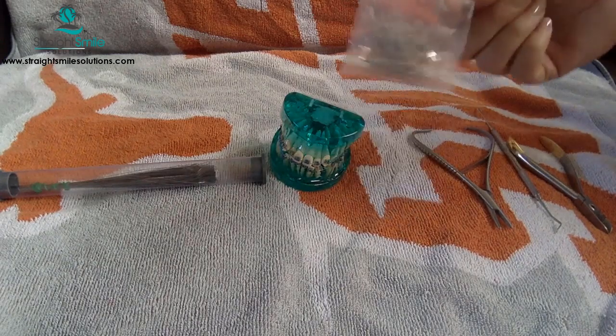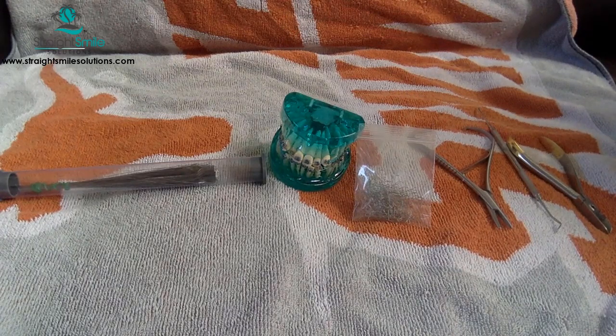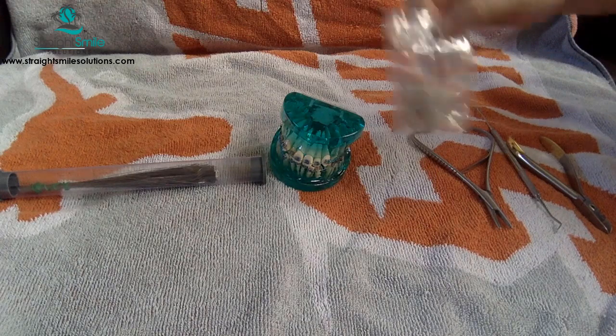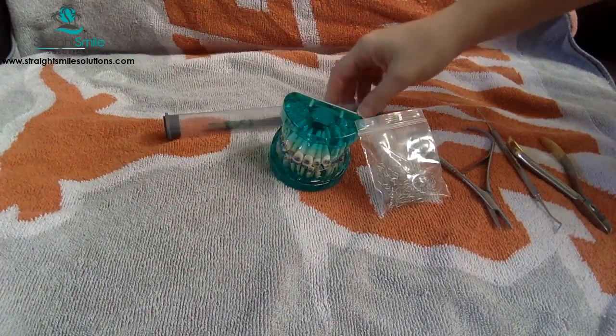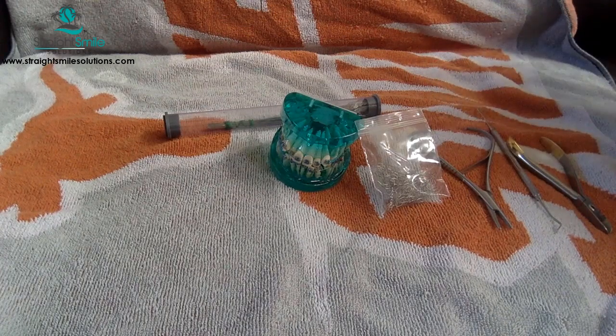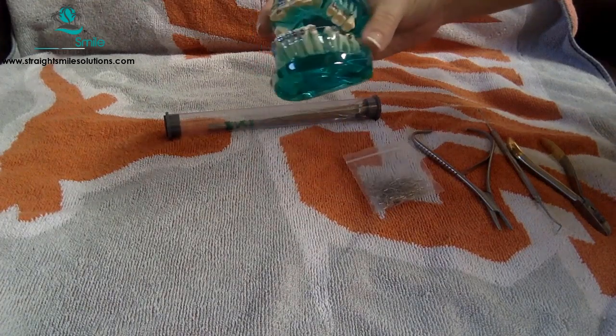If you start doing some research, you're going to notice the shorties and the long ties come in a variety of different gauges, maybe as thin as 009. You also have 010, 011, or 012. I generally use 010. I figure it's right in the middle. That's just my personal preference. Obviously, the smaller the gauge, the easier it's going to be to put on, but it's probably less secure at holding the wire. So just find what works best in your hands.